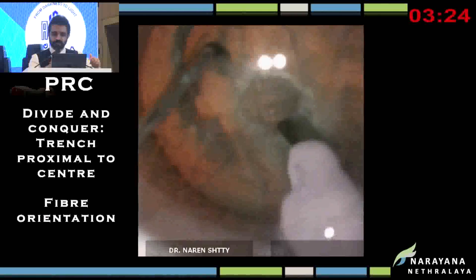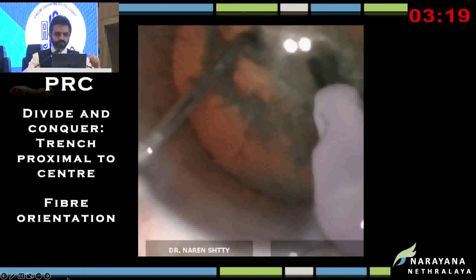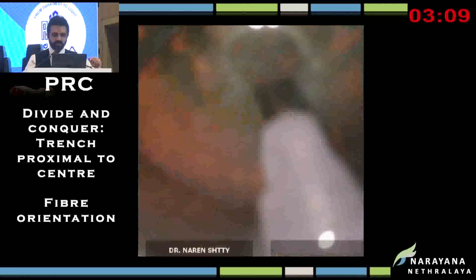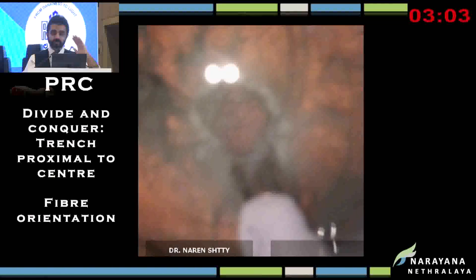Now, but if I move this forward, I can't see the cursor. Okay, anyway, let the movie play. So once I keep trenching, you can see the fiber arrangement suddenly changes. Now you can see it. Now I'm trying to zoom in and focus. Can you see the fiber arrangements? It is along the trench. So once it's along the trench, that means you've reached the right depth, stop, and then divide. You should get a good chop.